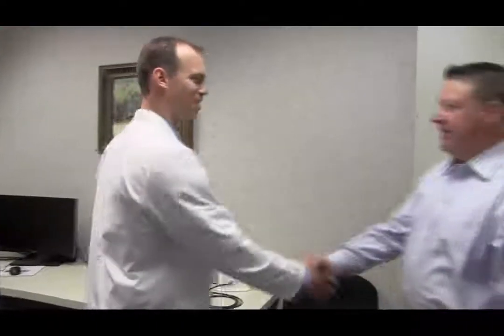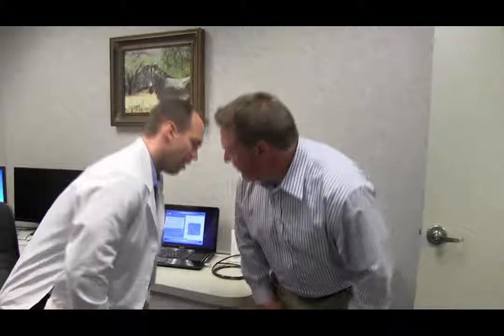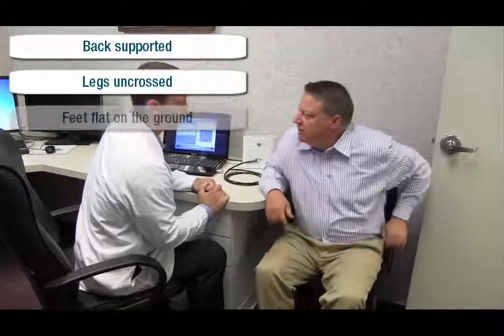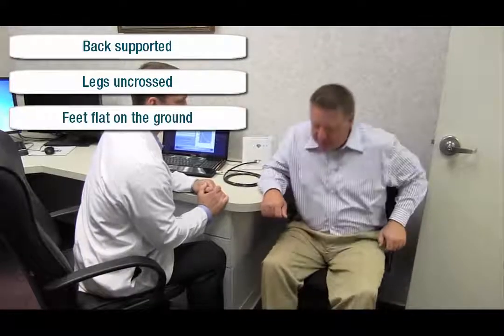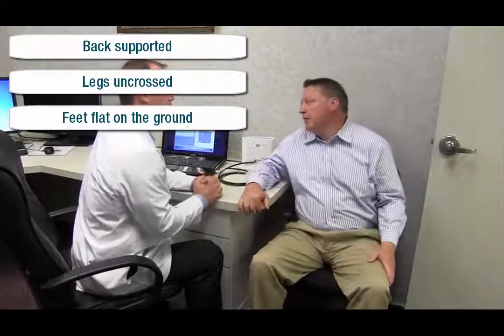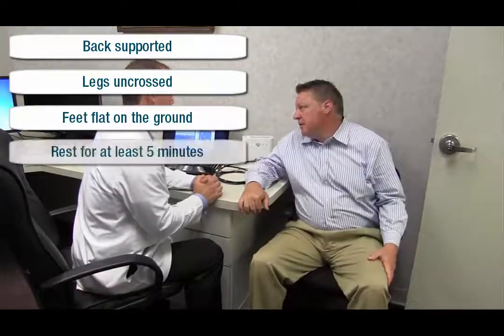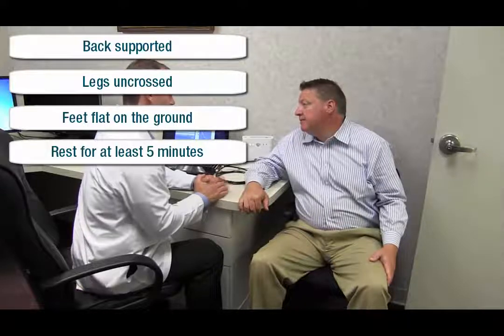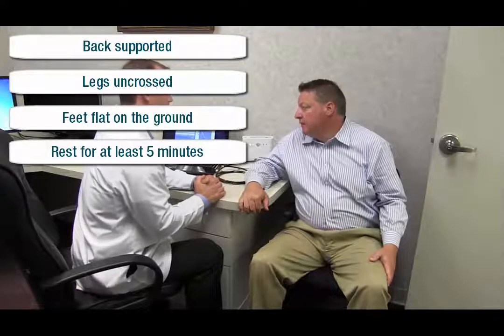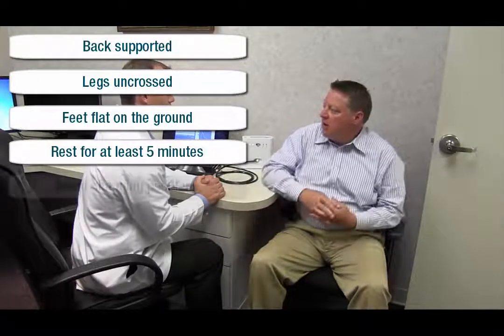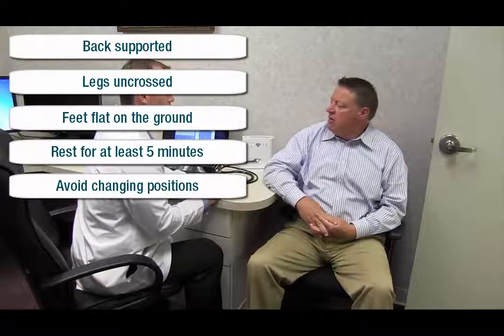To prepare for pulse wave analysis, follow proper protocol for brachial blood pressure measurement. Seat the patient in the chair so that his back is supported, making sure that his feet are not crossed and are on the ground. The patient should rest in this position for at least five minutes before the assessment begins, and remain in this position throughout testing.